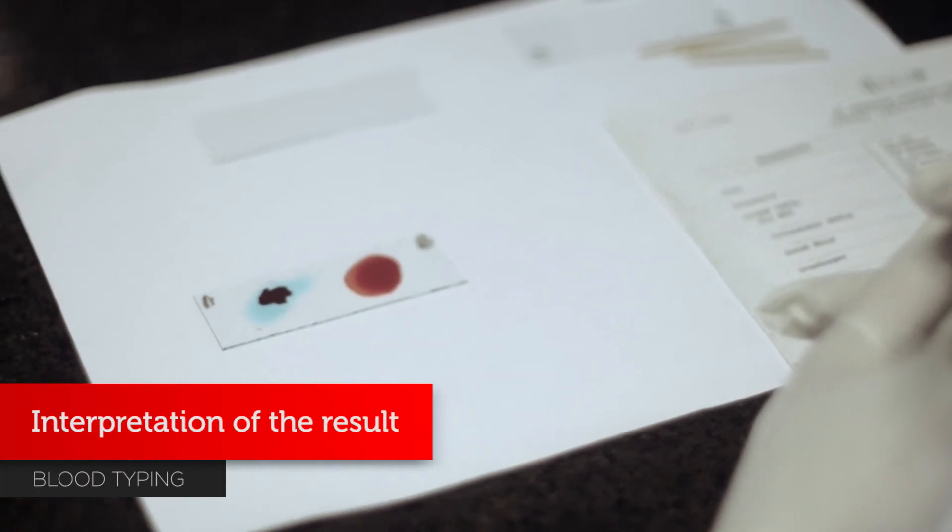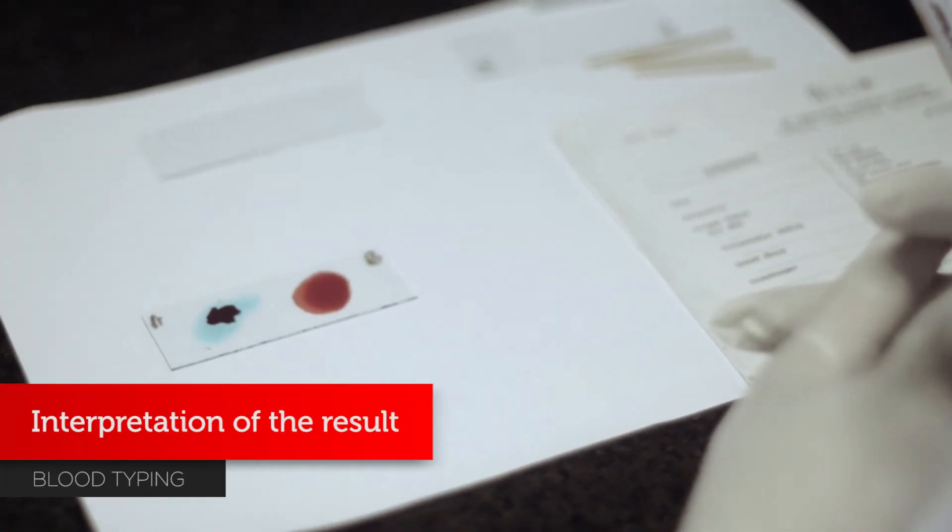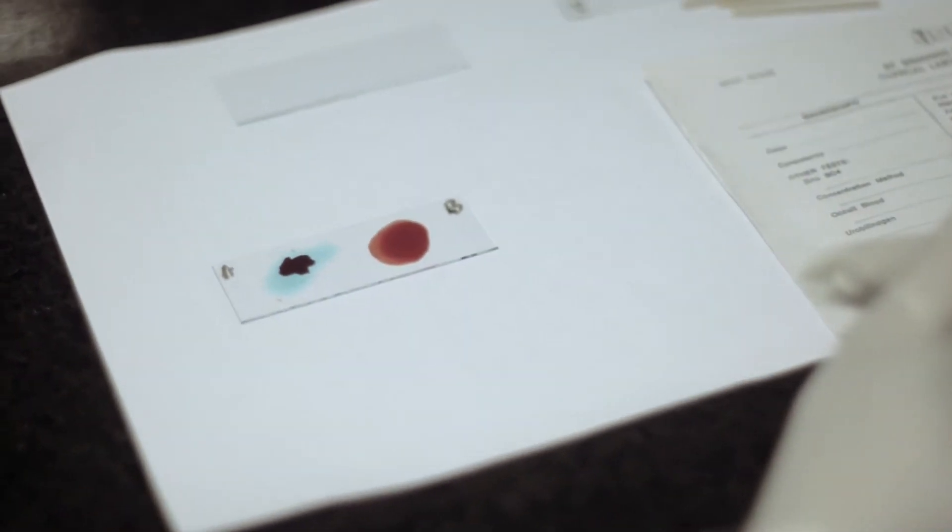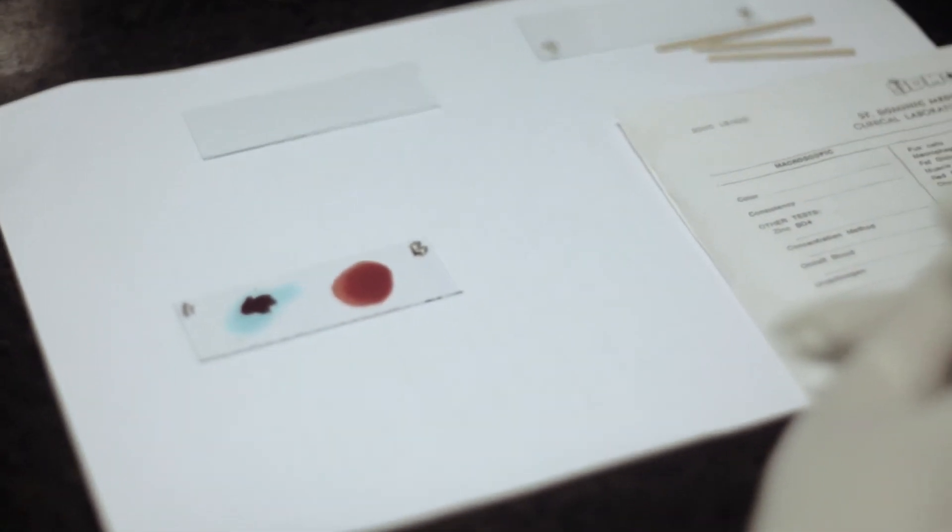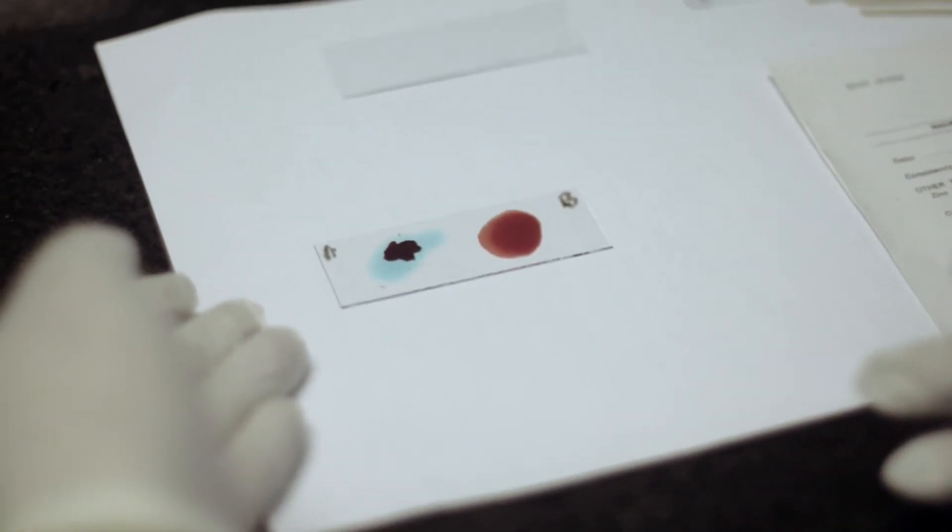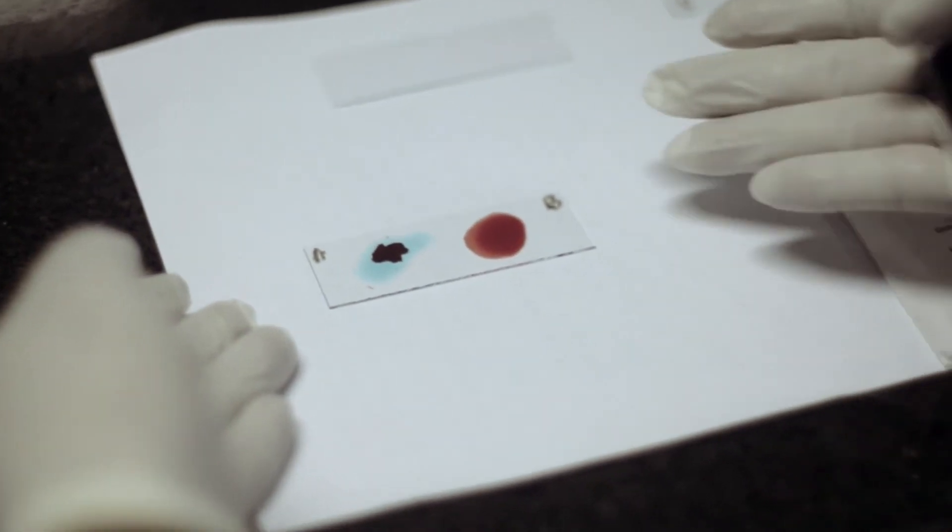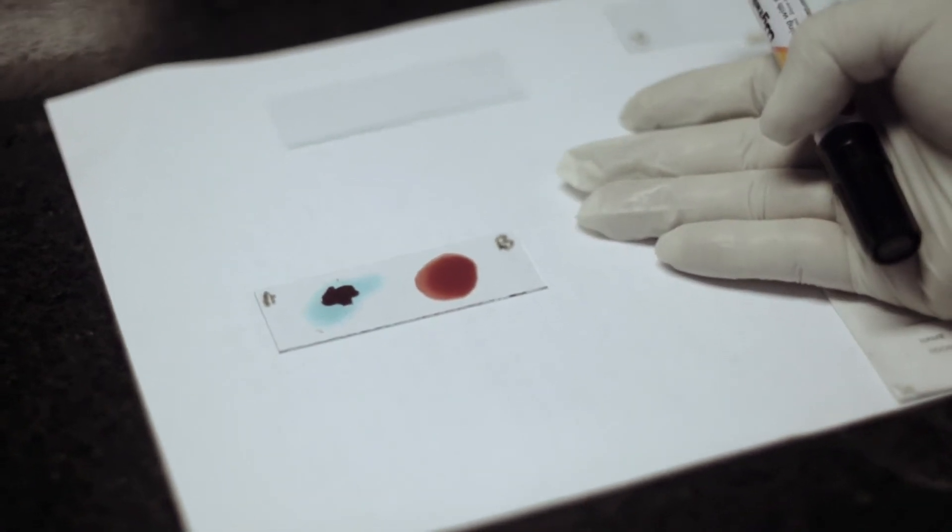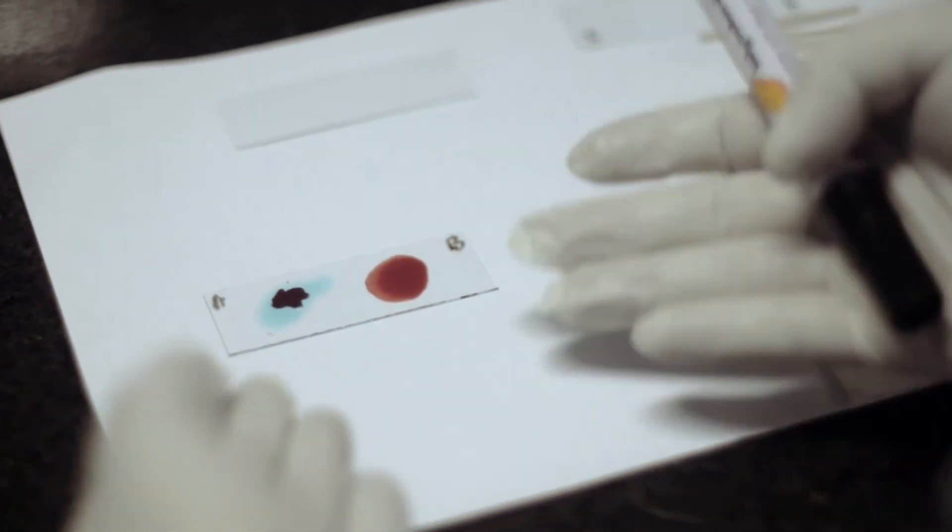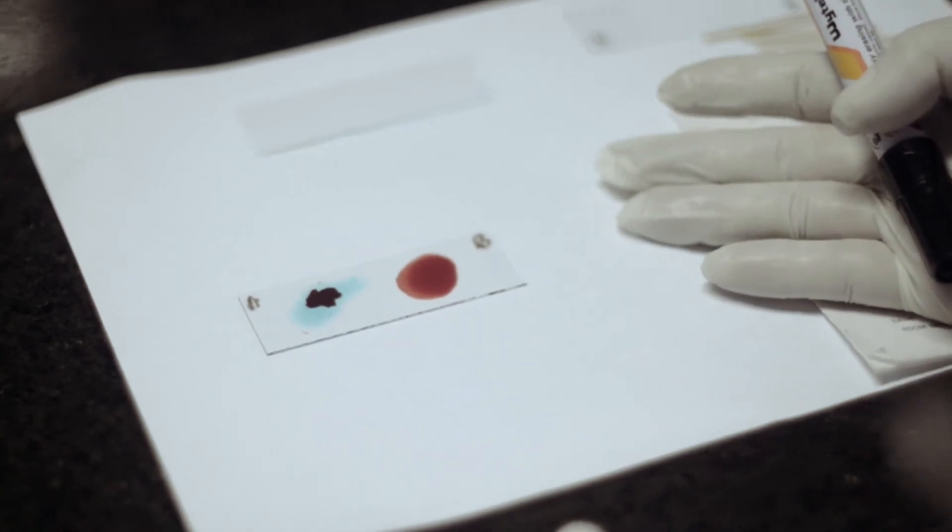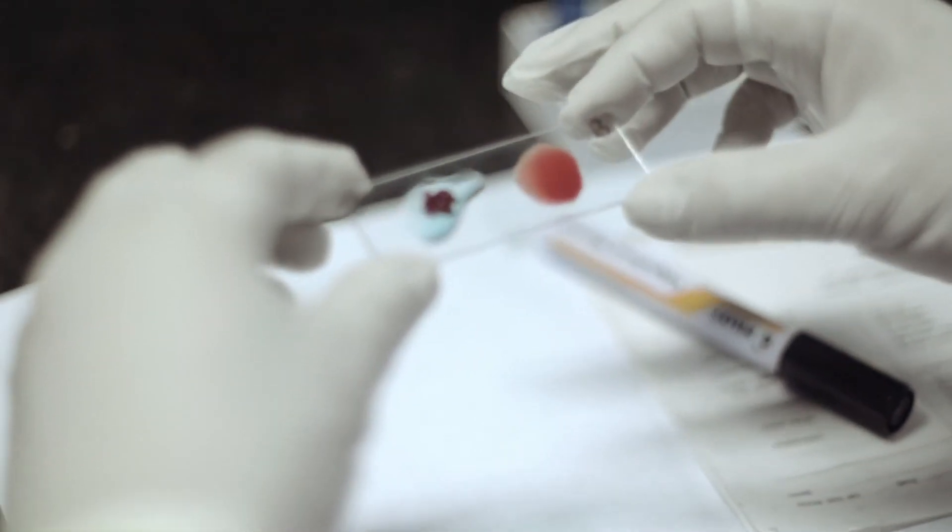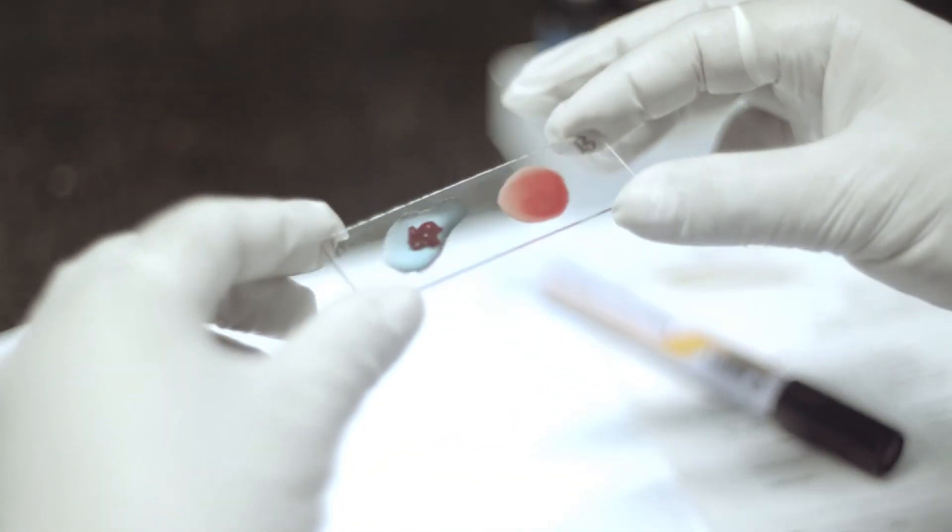Interpretation of the result: The blood group is determined on the basis of agglutination or absence of agglutination with anti-A serum and anti-B serum. The marked side where agglutination is observed is said to be the blood group or blood type. If both marks show agglutination, the blood group or type is AB. And when both marks fail to show agglutination, the blood group or type is O.